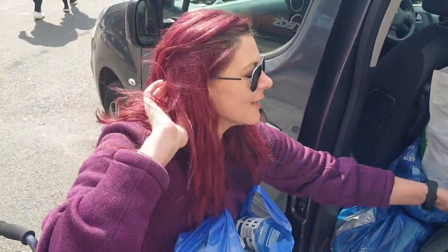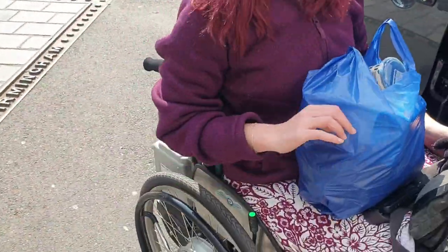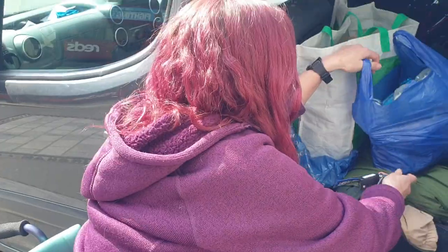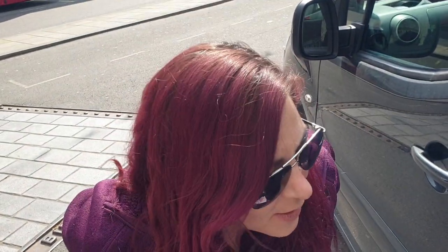So tell us about your wheelchair. These are e-move wheels. They are a computer-combination wheels — hybrid wheels essentially. They are a manual wheelchair with hybrid wheels that are electric. The batteries give it 70% extra power, so when I push, I get 70% extra power.